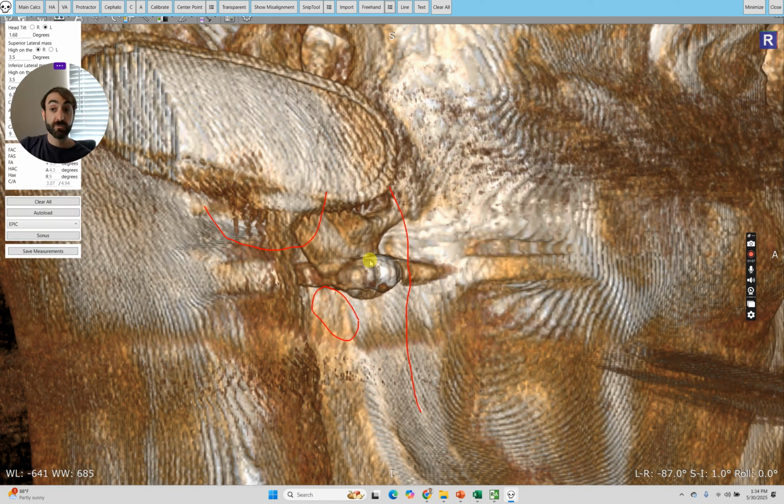And if I jump back over to Toolkit, then I can see where that mastoid is, where their jaw is, where their TP is, where their earlobe is. And I'm really looking at all of that when I'm aiming my machine right to make sure it hits that TP. And of course there's going to be 1 to a half inch of soft tissue between that TP and the surface. So I'm not necessarily going to have the machine right over. I'm going to have the machine usually up in this area if it's an anterior, or up in this area if it's a posterior, to make sure that my ray is kind of coming straight at that TP.